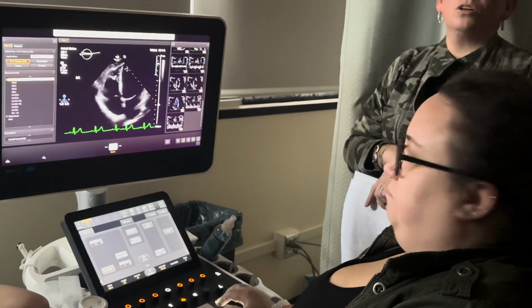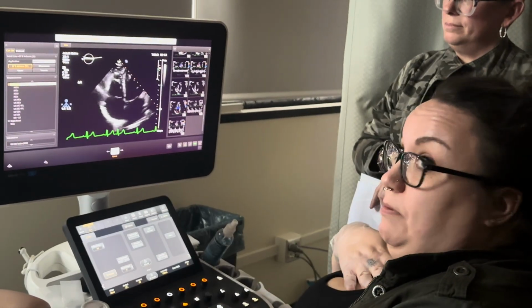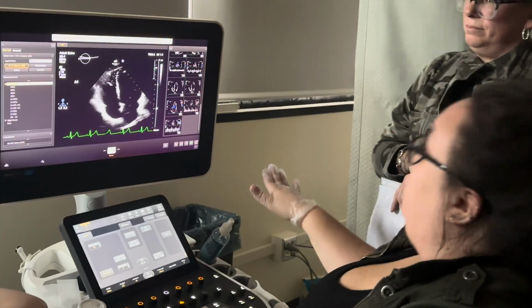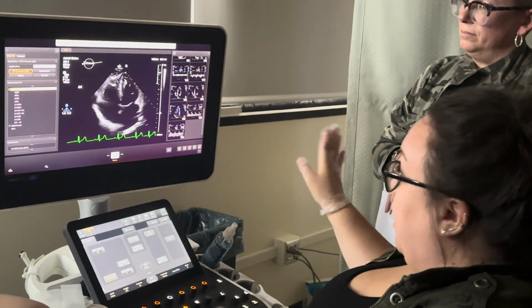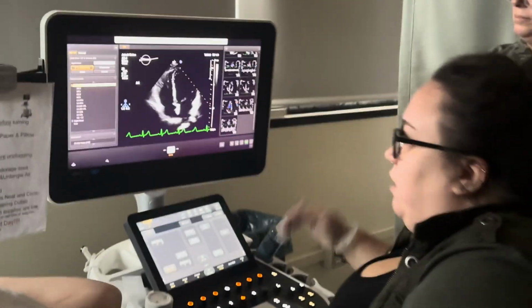to be your best spectral. Correct. You gotta move around. At my hospital, our doctors hate color compare. They actually do not want us to do color compare. In their eyes, they say it degrades the image too much. I get it, whatever, they're the ones reading it, but that's why it's do whichever one you feel more comfortable with, whichever one looks better on the machine.